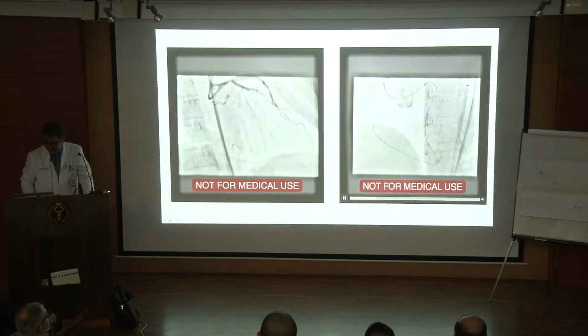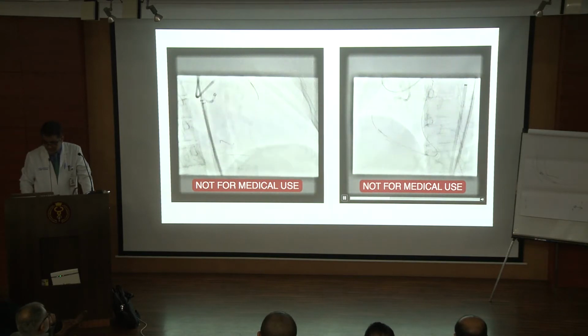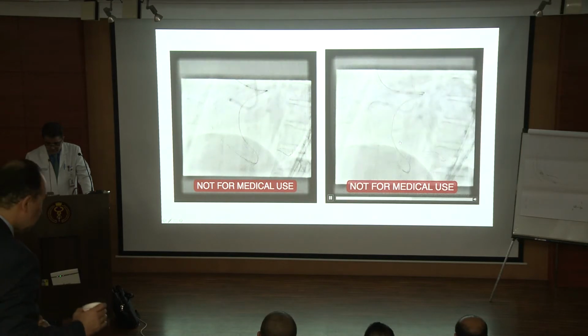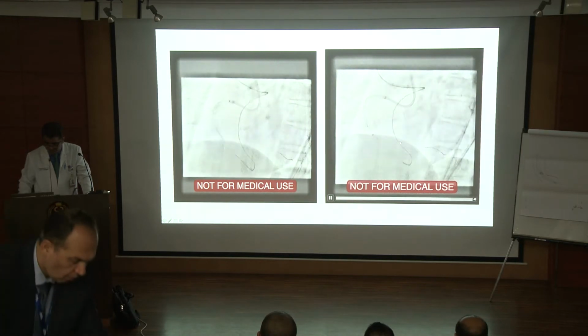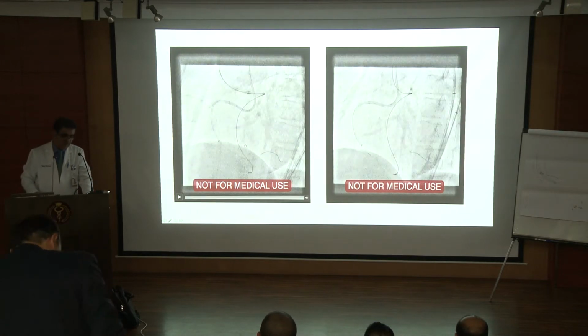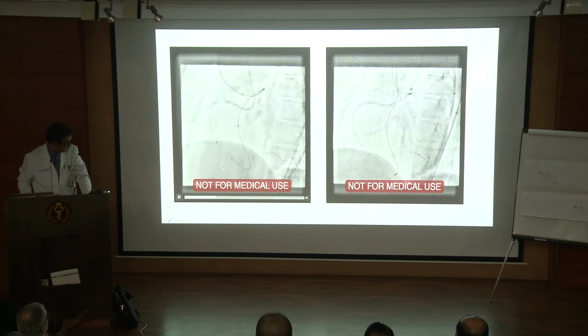Went up. Externalize the wire. Stenting. And then we change all these wires over dual lumen antegradely. Take the Guideliner down.